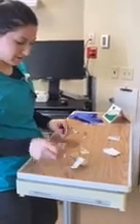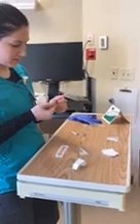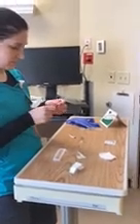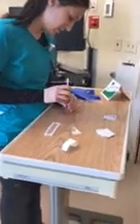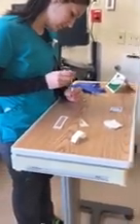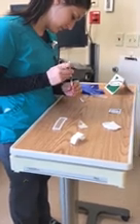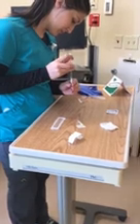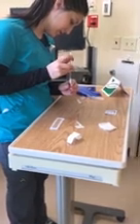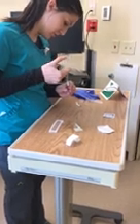I'm going to take my filter straw out. Go ahead and draw up the 0.4 mils. Perfect. And I actually drew up a little over.